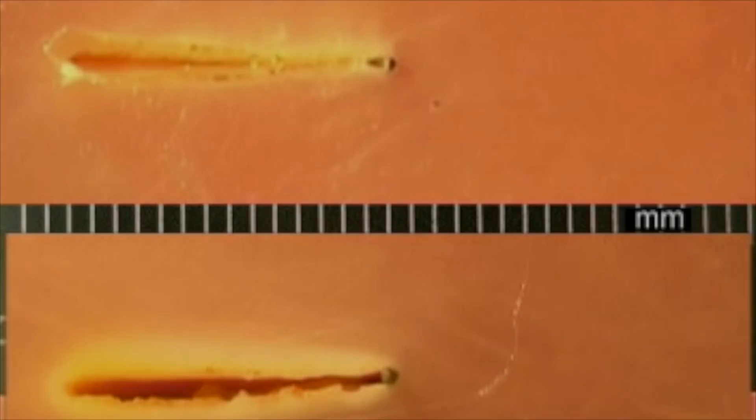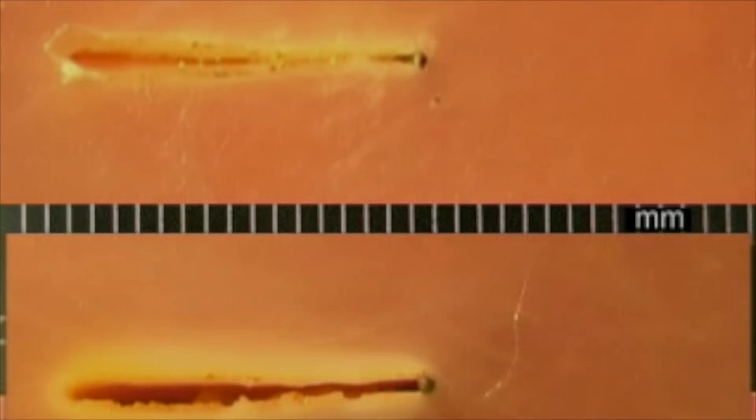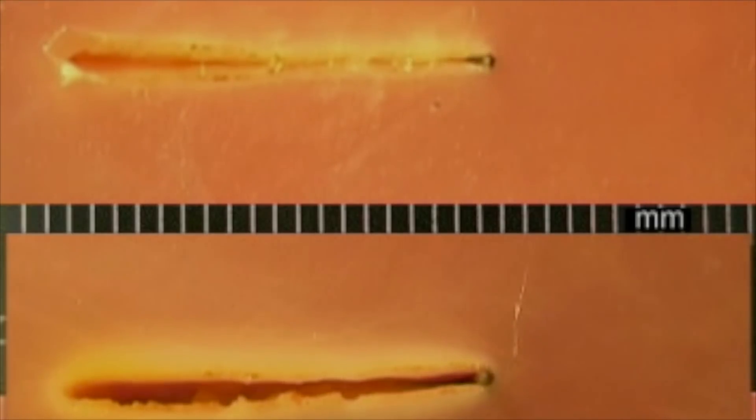Clinical situations where a higher effect might be desired include times when there is concern for immediate bleeding, such as with cutting through a pedunculated polyp stalk. Similarly, effect might be set at a minimum in portions of the intestine where the bowel wall is thin, such as with the cecum, to minimize the risk for perforation or post-polypectomy syndrome.